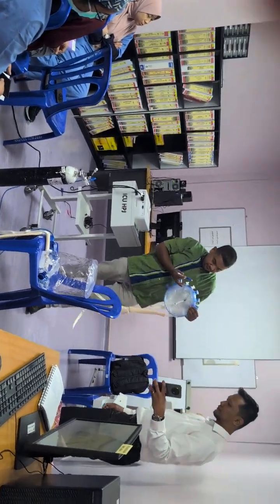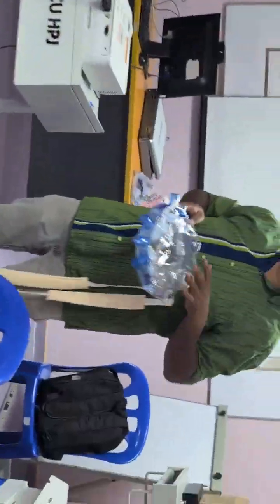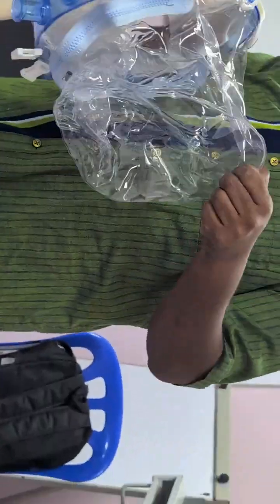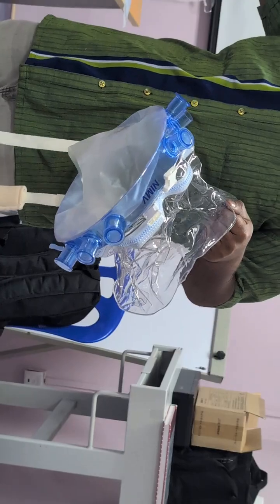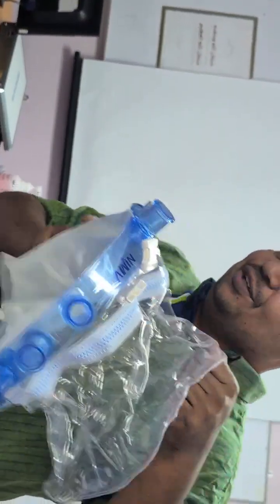An NIMV version. This is to be used with your ventilators. Now, the newer ventilators have a helmet setting. So you put this on.